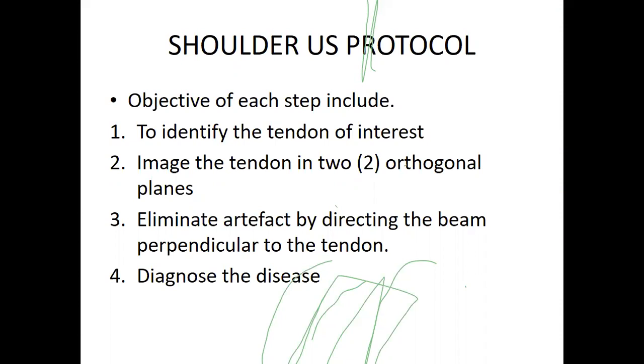I should also mention here that protocols may differ depending on the institutions, but one clear thing should come out: a comprehensive, systematic, logical evaluation of the shoulder joint must be achieved regardless of the protocol that you are using. The major objectives must be achieved.